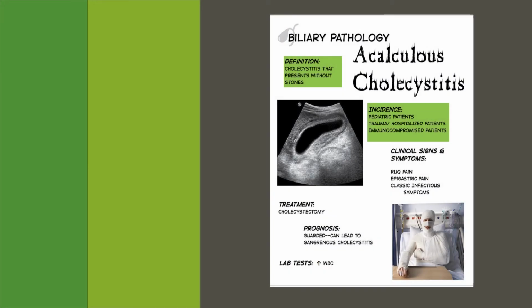Acalculous cholecystitis is not a super common pathology that you're going to scan unless you work in a high-risk population group. I have personally never seen it, and I do pediatrics and have worked in hospitals before, but it's important to recognize what the symptoms are of it, who is more at risk for it, and how to ultrasound it.